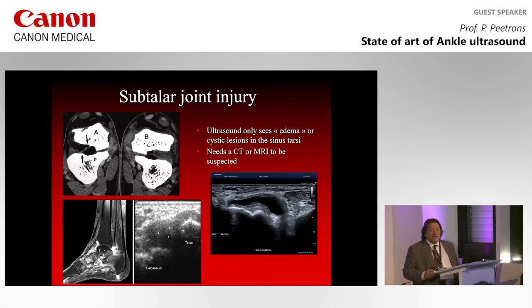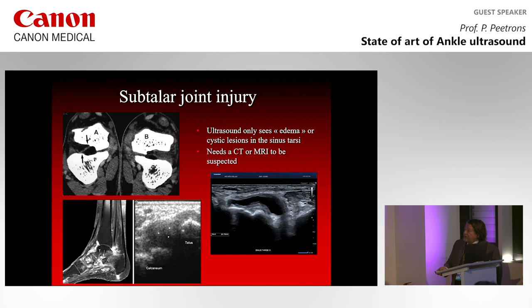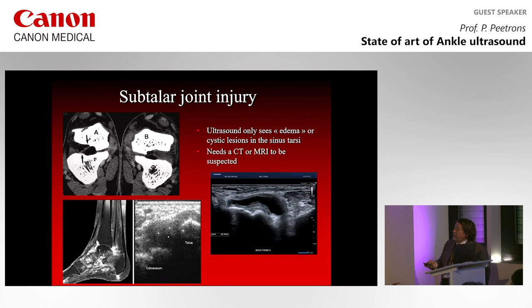Subtalar joint injury is sometimes difficult to see with ultrasound because we can only see edema coming from the subtalar joint, and this is much more seen in MRI than in ultrasound. Or we can see some cysts coming from the sinus tarsi, but sometimes, I'm sorry, we need MRI or CT to be sure.